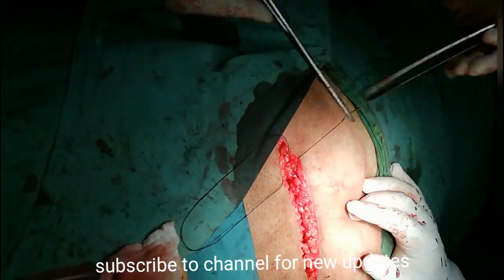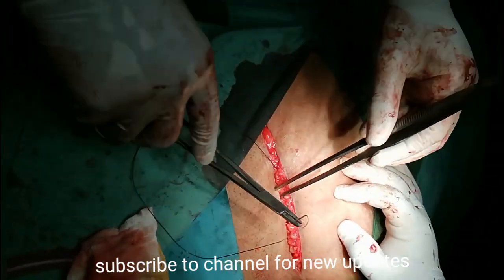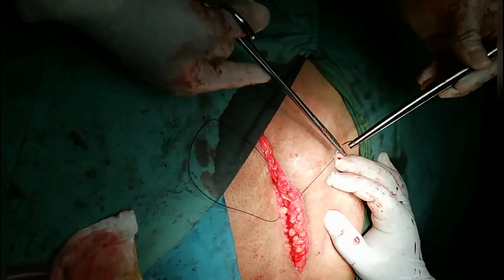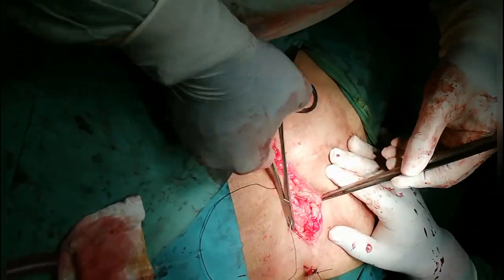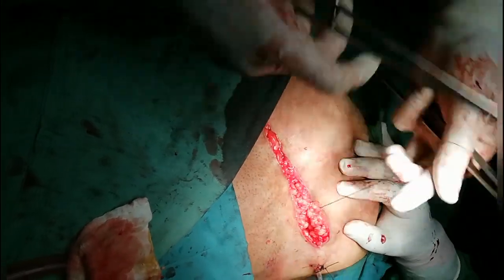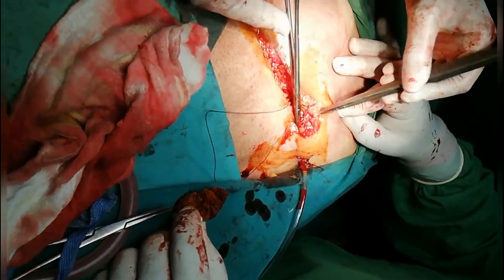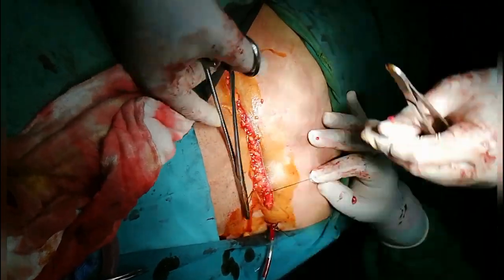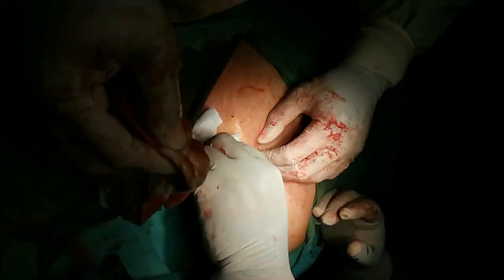After placing the mesh, we will close the subcutaneous tissue plane, but before that we must place a drain. The drain must be a suction drain placed in the subcutaneous plane. The suction drain will obliterate the cavity, drain out any seroma formation, and approximate the subcutaneous fat. If you are using a suction drain, there is no need to separately close the subcutaneous fat — the suction itself causes obliteration of the cavity and prevents seroma and hematoma formation.